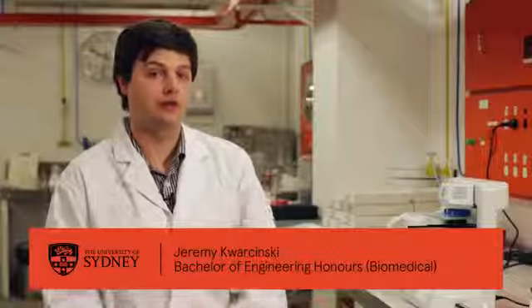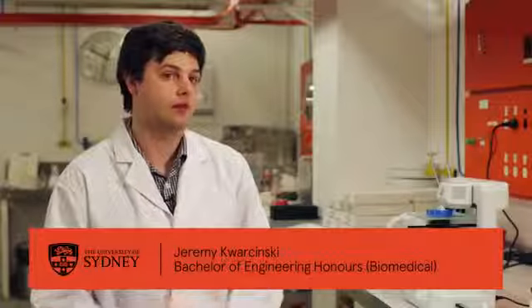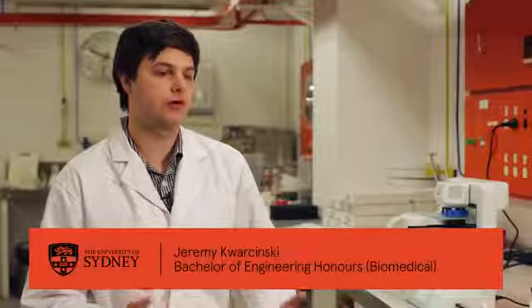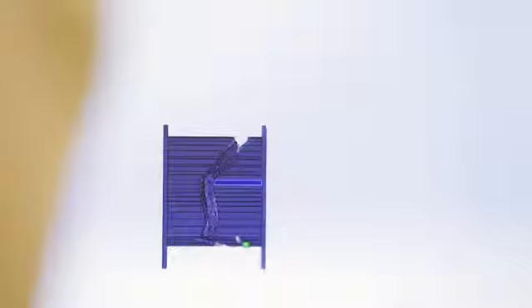So I'm working on a collaborative project involving University of Sydney students, academics and of course clinical technicians, and we're involved in creating patient-specific implants for skull injuries. We have developed a rapid templating technology which allows us to create patient-specific implants. Rapid templating is the creation of a two-part mould using 3D printing.